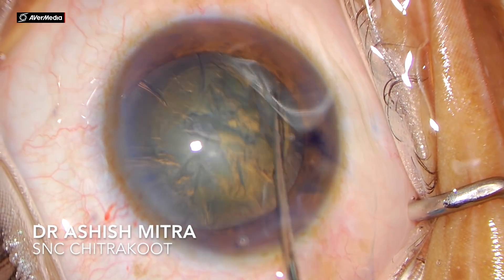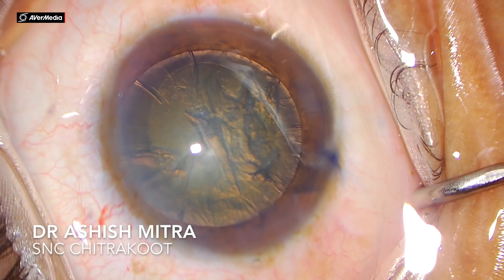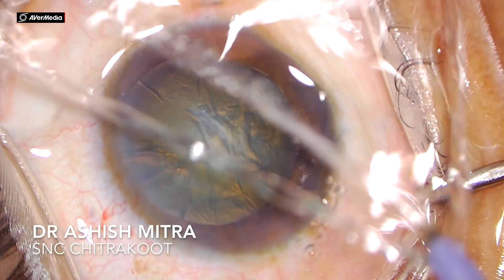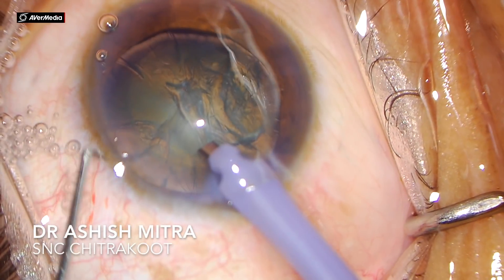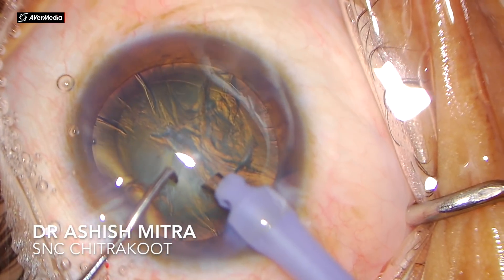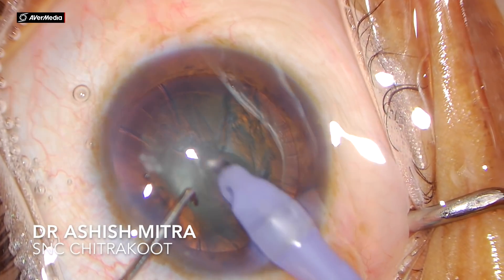Once done with rhexis, you do hydrodissection and dial the nucleus. In soft cataracts you sometimes have cheese wiring, so what I would recommend is the tap technique, which I demonstrated in one of my previous videos, through which you can easily dial these soft cataracts. My phaco probe is now inside the anterior chamber.